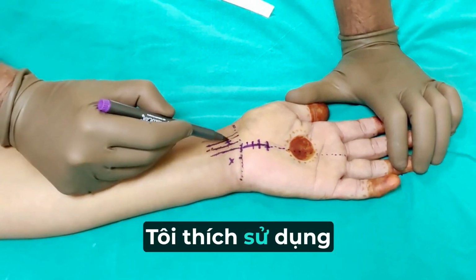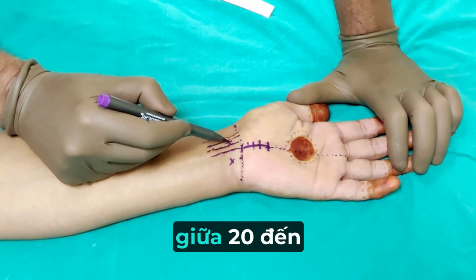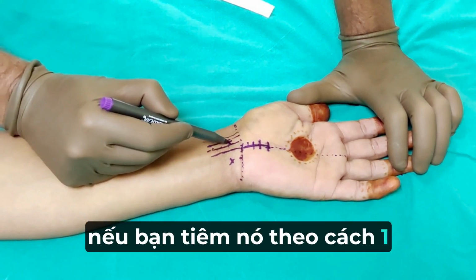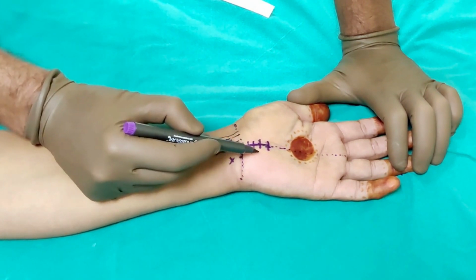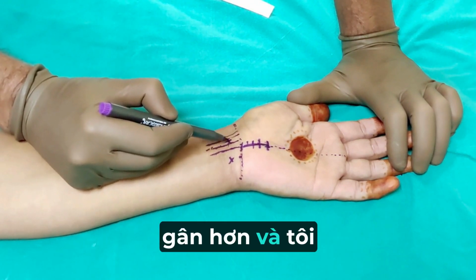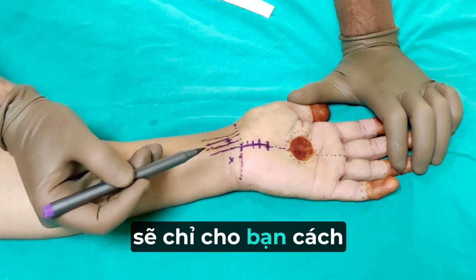And the reason I use the radial approach is because you have to angle your needle at roughly somewhere between 20 to 40 degrees. I keep it around 30 degrees. So if you angle it like this, you are away from the median nerve, because the median nerve is slightly more ulnar, and that is the reason I prefer to go in between the tendons, and I will be 1 centimeter proximal. So now I'm ready for my injection, and I will show you how I do it.